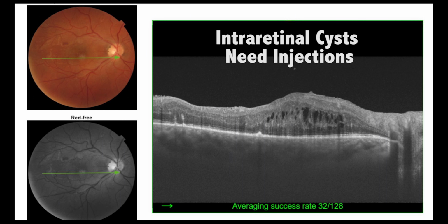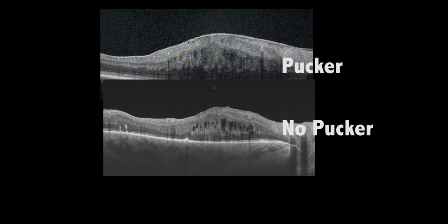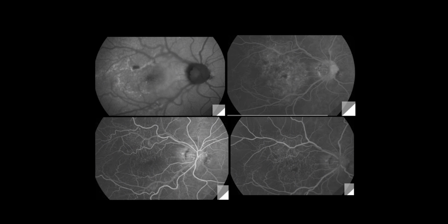These are the postoperative OCTs and the retinal pictures and FA showing a pretty good macula, of course still with cysts due to chronic traction and edema, the traction now being totally relieved and a better chance for treating the edema with anti-angiogenics.